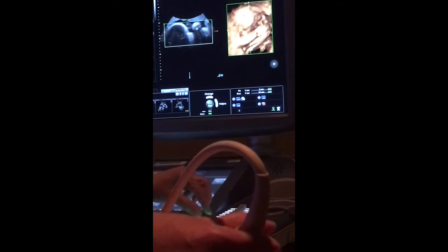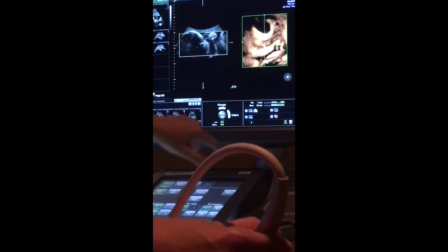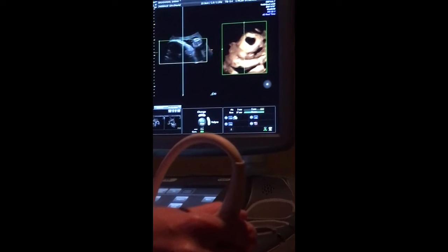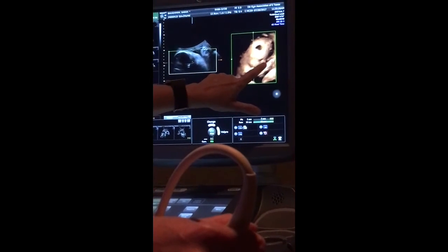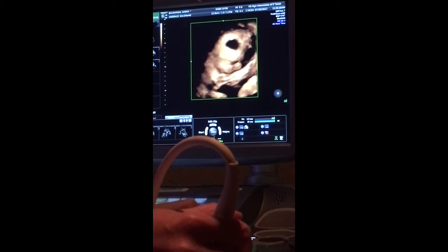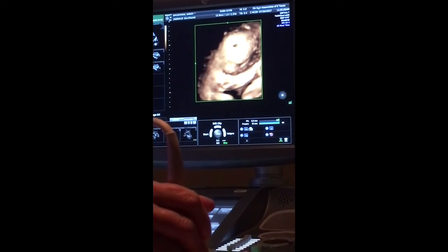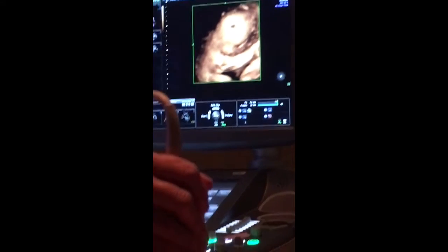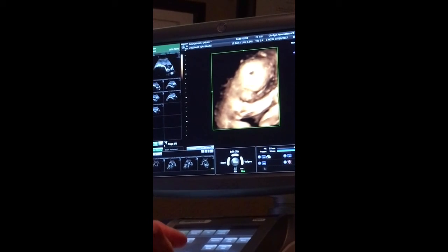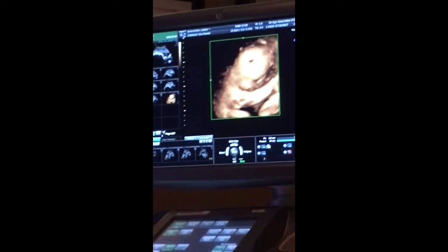Oh, wow. Okay, let me give you an idea of where, that's her head, top of her head almost. She's kind of looking down that way, and then she's got an arm coming up and a leg coming up. See the hand. You can kind of see, trying to turn it, a little bit of the bridge of her nose there, and the indention of her eye, but you can't see a lot of her because there's a piece of cord right there. Looking through cords is kind of like looking through a shower door. You know how you can see through them, but it's blurry. It'll be the same way when it overlaps something, so you're having to look through it to see her. But you get an idea of where she's laying in there.